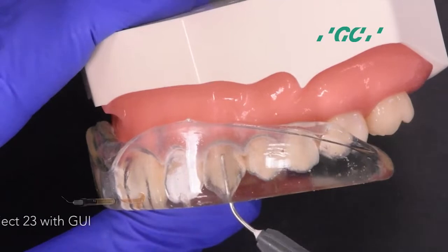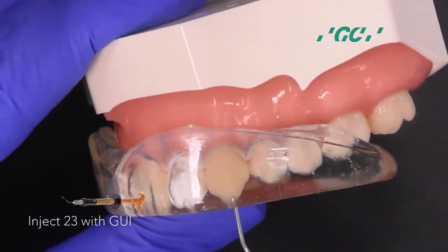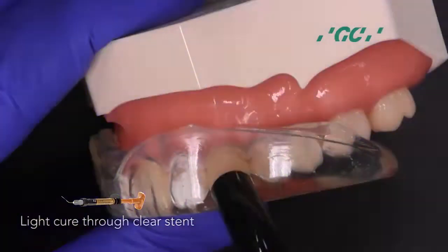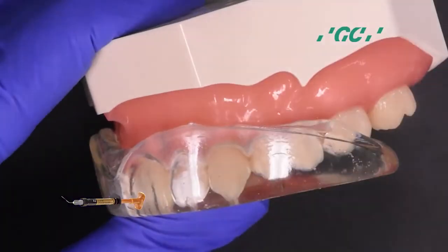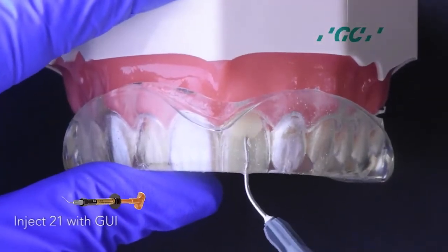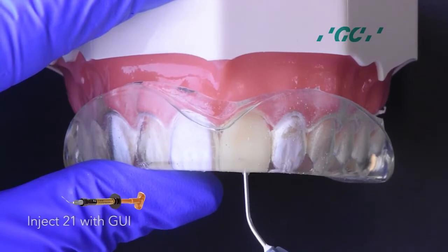Start injection moulding on 2-3 with Genial Universal injectable composite. This composite is a universal restorative displaying exceptional strength, aesthetics, and uniquely high thixotropic viscosity. Inject 2-1 with Genial injectable, then light cure.